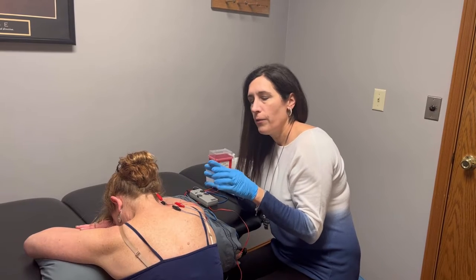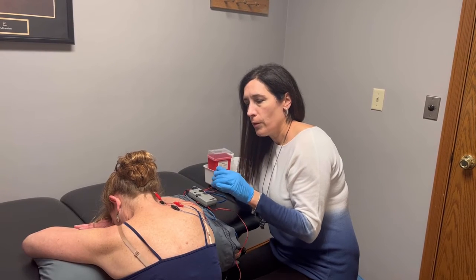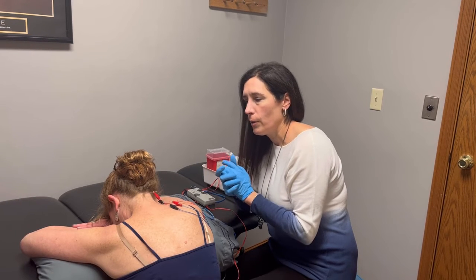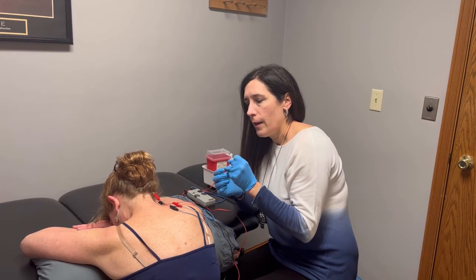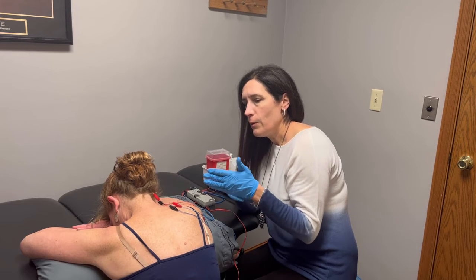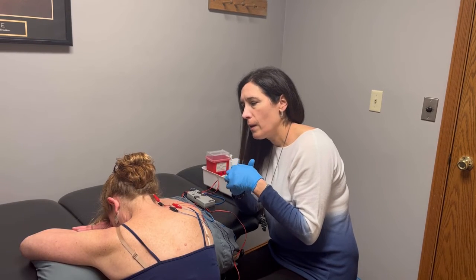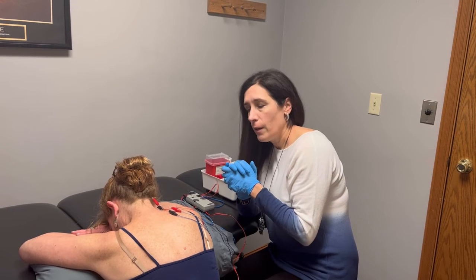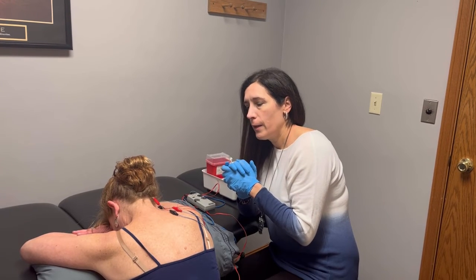I also try to find trigger points or taut muscle bands, and I insert the needle there to help break up that adhered tissue. Sometimes you'll see a twitch response. It's not all the time. If you do, that's a good thing and you've hit a good spot, but it's not something that you really need to focus on.